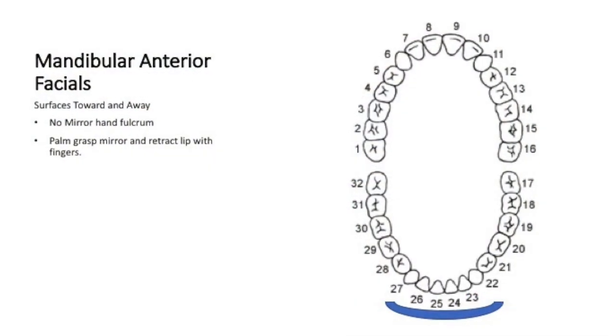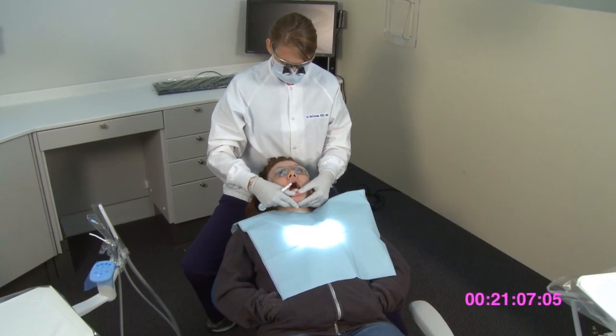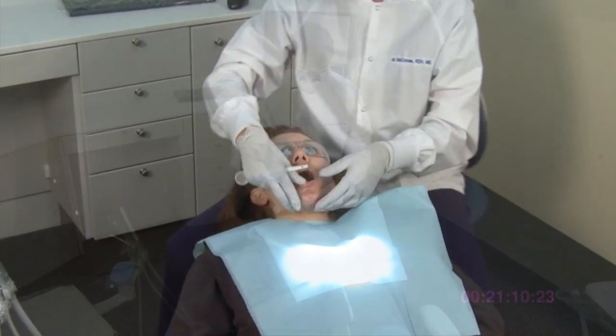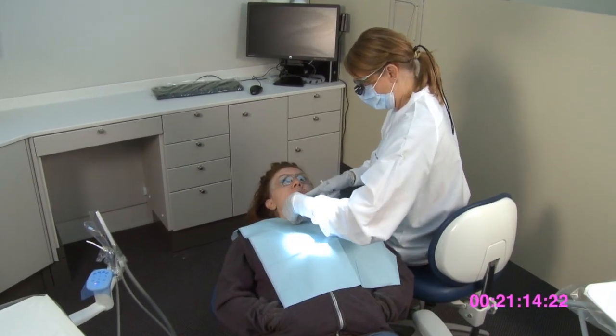Mandibular anterior facial surfaces away. You will palm grasp the mirror and retract the lips with the fingers. The patient's head is in neutral, but the chin is down. The seating position is between 12 and 12:30.